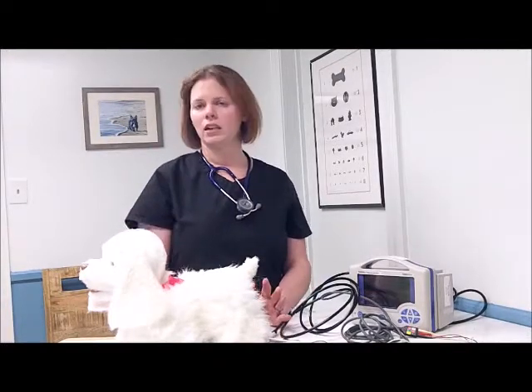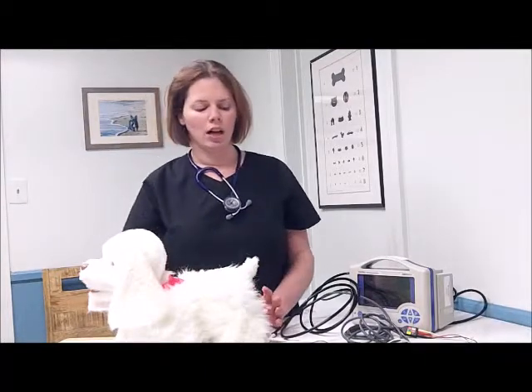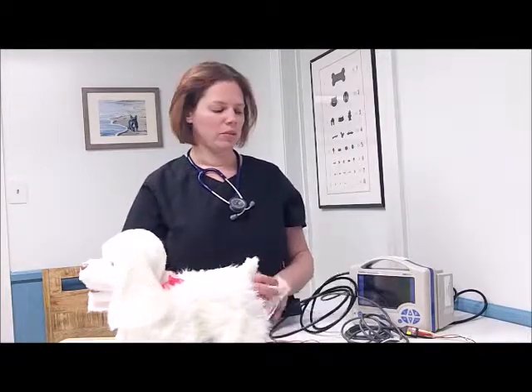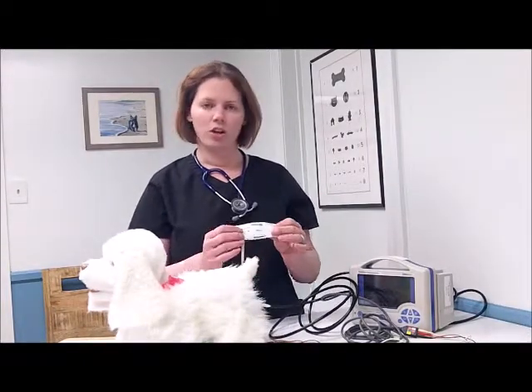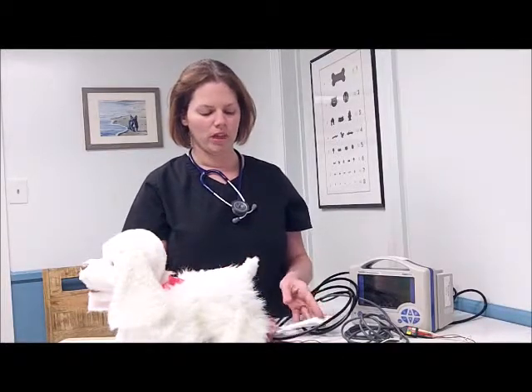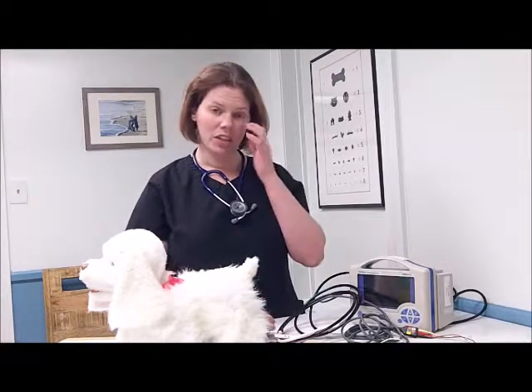Those are the two main physiological status systems that we monitor. But again, we have different monitoring equipment to understand our patient. I mentioned blood pressure. Many machines are built in with a blood pressure monitoring device. Blood pressure is useful in determining perfusion to our tissues. A lot of times during anesthetic procedures, our perfusion, our blood pressure, tends to lower.